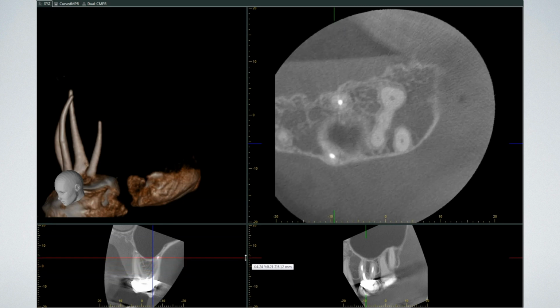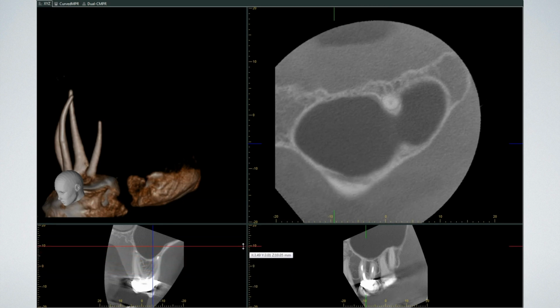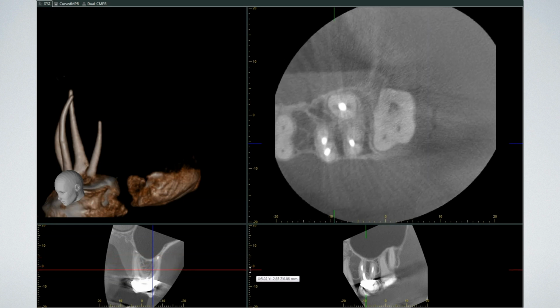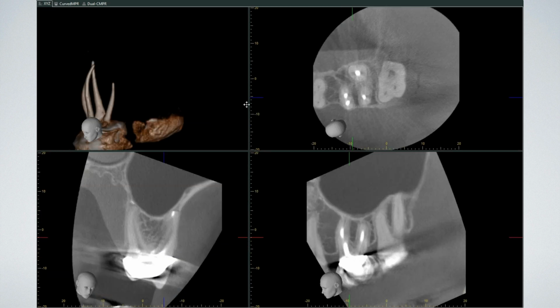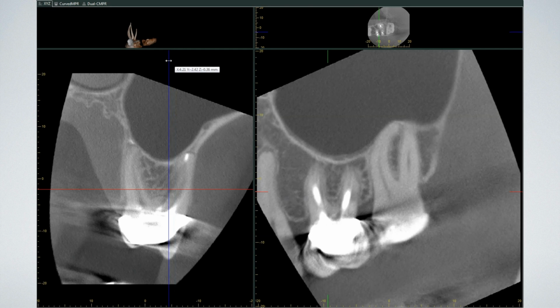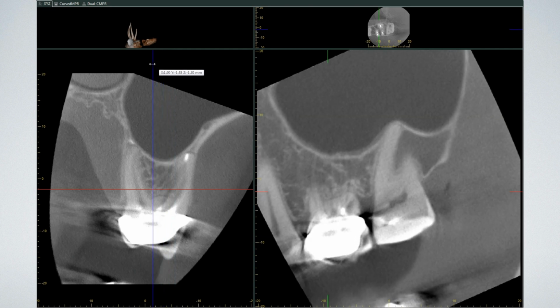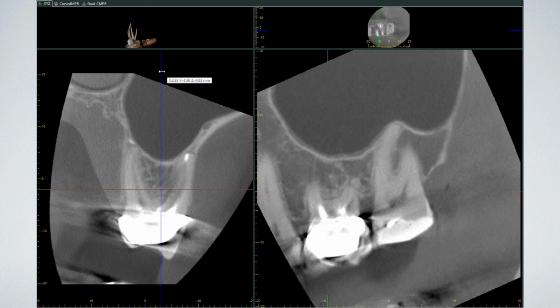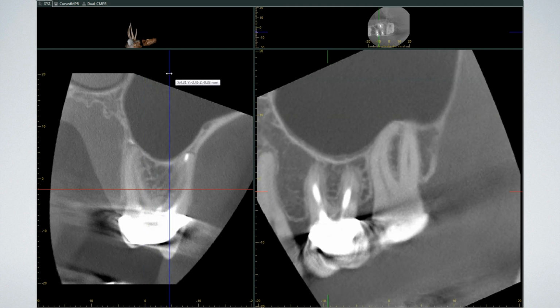So that's what we know ahead of time, and thank God for CBCTs to give us that information, because as you can see, the MB2 in this particular case is fairly lingual off of that mesiolingual line where the MB2 would normally be found. Based on the Coolidge study, we've been looking at about a couple of millimeters from the MB1, but this is more like 4 millimeters or longer.